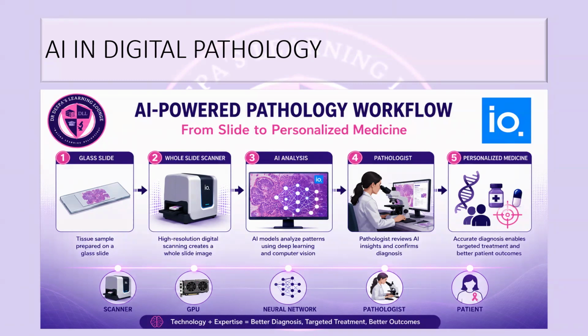While radiology has rapidly embraced the change, pathology has continued largely on glass slides and conventional microscopy in many countries. Even now, there are smaller institutions that still don't use whole slide imaging. To my knowledge, nearly 60% to 70% of the labs, even today in India, have not adopted AI and digital pathology yet. So the landscape is continuously changing.